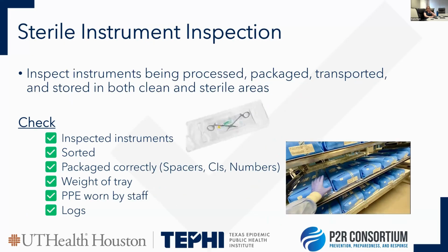So then after it's been ran through the sterilized side, after it's complete the sterilized process, you look at the printout, you see that time, temperature, and duration has been set. It has passed. You want to make sure then you're inspecting the instruments, that you're looking at them. You can see the changes in those external indicators, that they have changed appropriately.